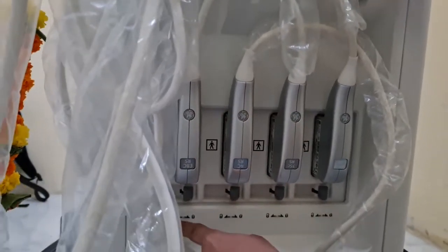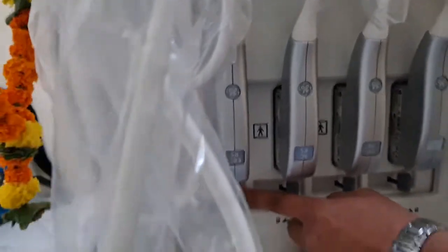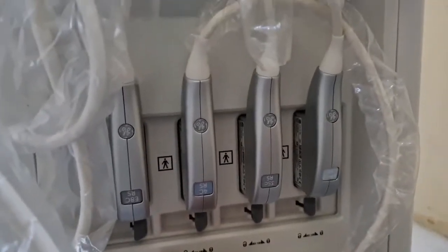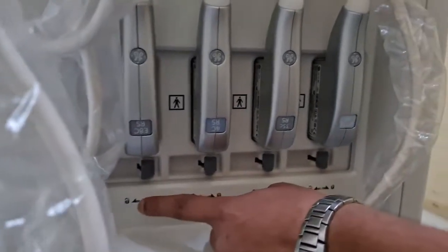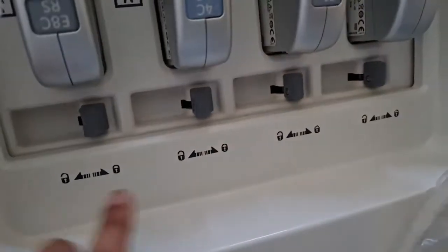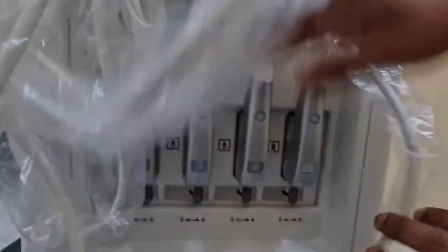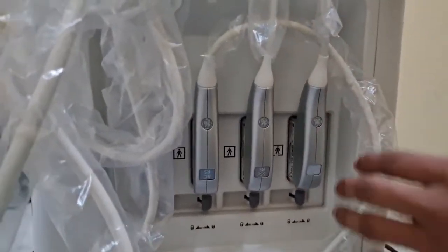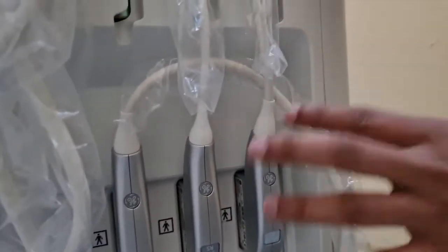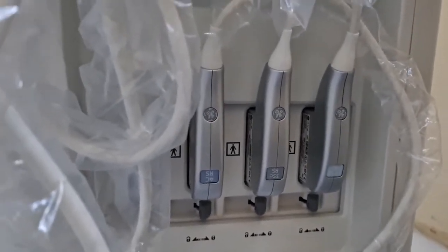This is the lock. This is the direction also given. If you move it to the left side, it will become unlock. And if you move it to the right side, it will become lock. See, these are the directions given: unlock and lock. The direction of all these probes should be like this. If any of the probes is connected upside down, the board might get damaged, or the probe might get damaged, or the machine will not work properly.